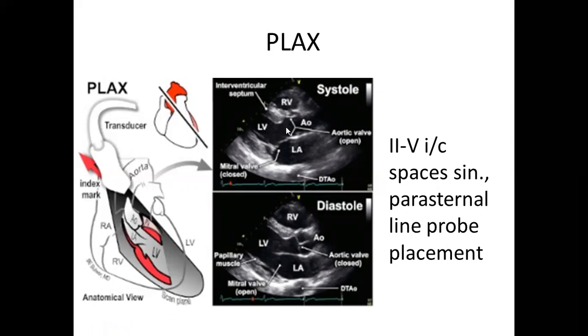And here in the middle, you can see the image which we will achieve. The first thing we may notice in the upper area is the cavity of the right ventricle. All cavities are going to look anechoic with dorsal enhancement. Dorsal enhancement you can see right here, right behind the cavity of the right ventricle, where we have the interventricular septum, the myocardium and pericardium.